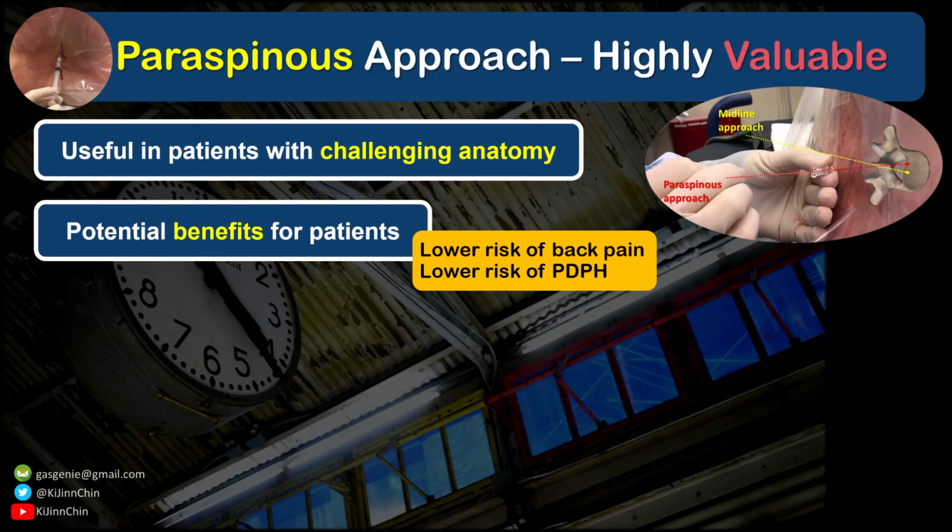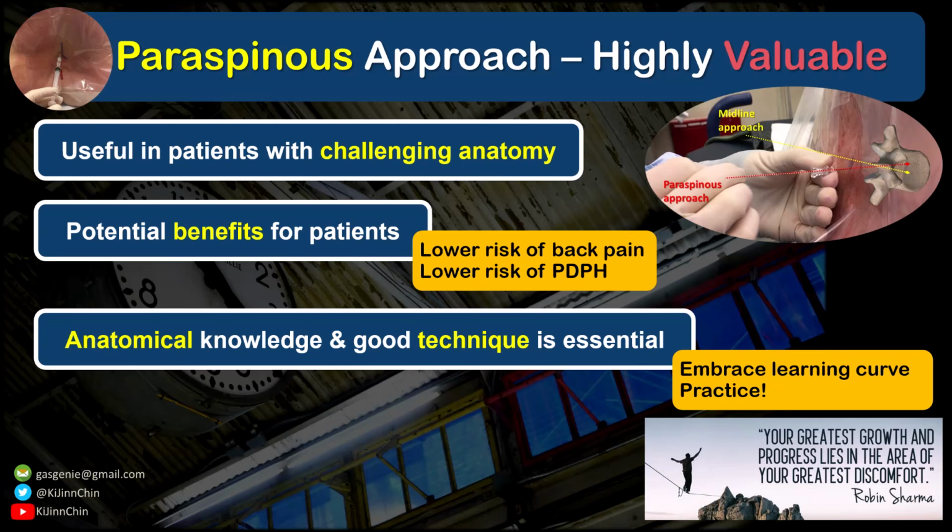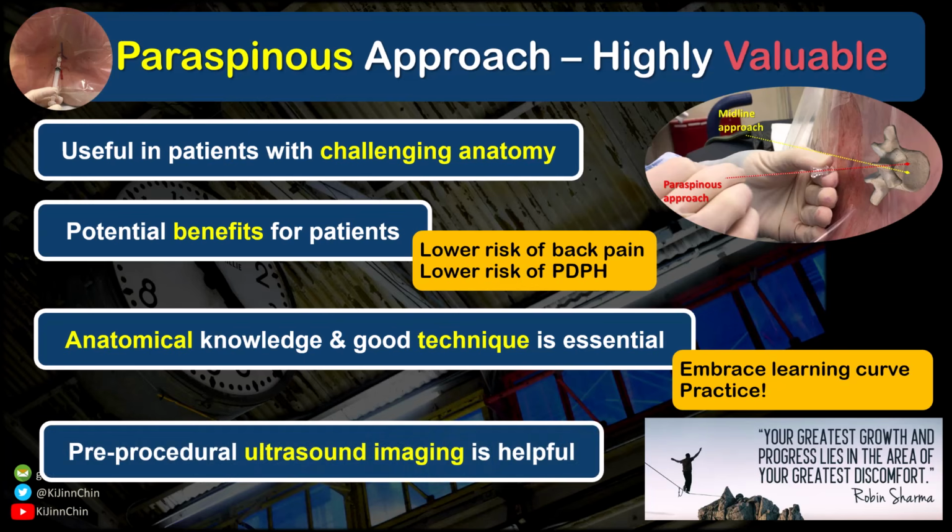But like all skills, if you want to use it effectively, it requires that we understand the proper technique and the principles involved, and that we invest a decent amount of practice to become truly expert. I personally make sure that I go out of my way to keep doing it and to improve my own competence. There is no doubt that ultrasound scanning is helpful. I prefer pre-procedural scanning and marking, but again, I note that my technique is somewhat different from that described in most papers, and you'll have to figure out which one works for you, especially in the truly challenging patients. At this time, I continue to have my doubts about the utility of real-time ultrasound-guided neuraxial blocks, but I would encourage further exploration, especially in difficult thoracic epidurals.